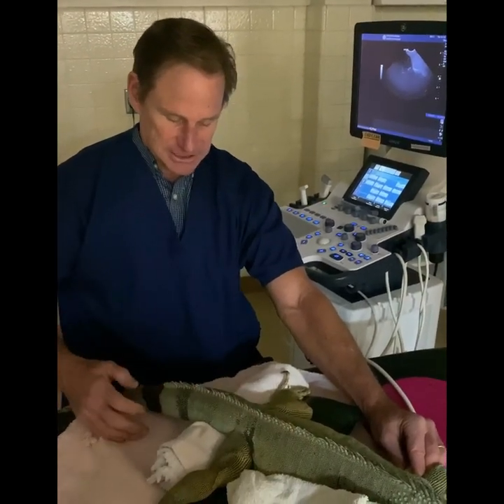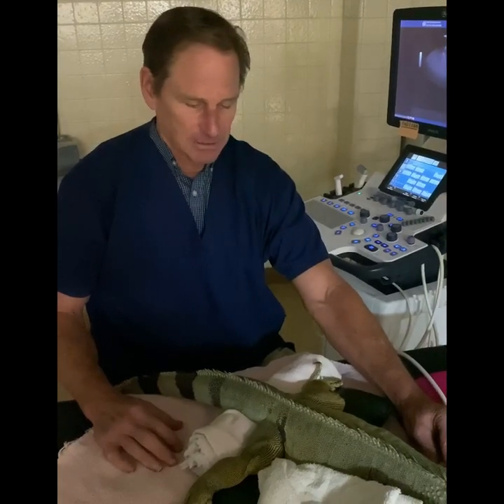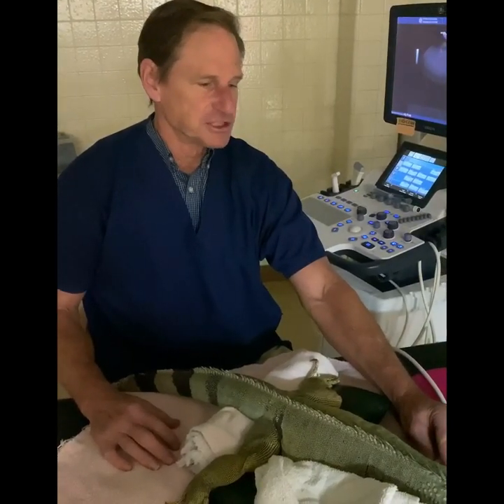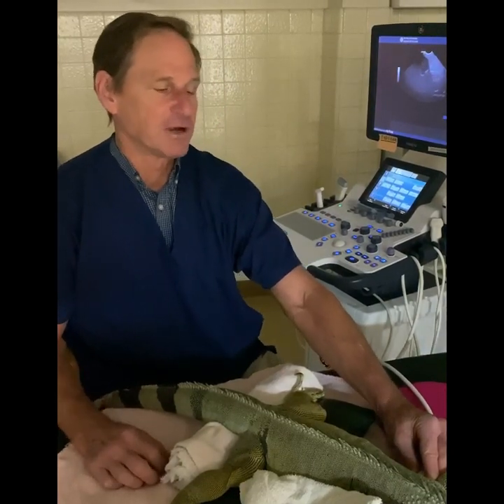Zohan is here this morning. Zohan has a very severely infected tail. We have him completely under anesthesia — he was induced with propofol IV and then intubated and running on isoflurane and oxygen.